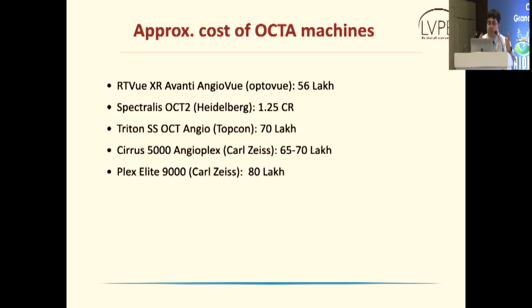Last, the cost. I have listed the approximate costs for each of these machines. Now you have to understand what you require in your practice, how much you can afford, and then take a call on what suits you best, keeping these costs in mind.